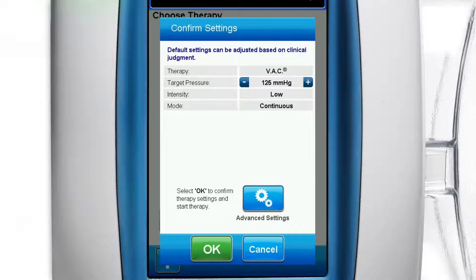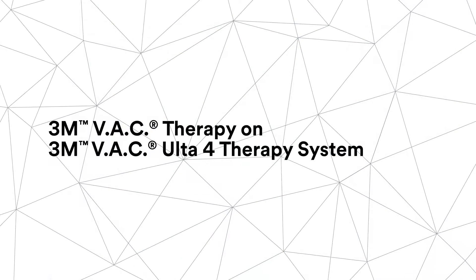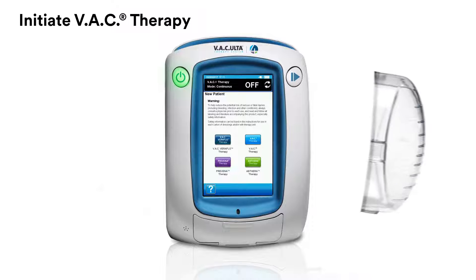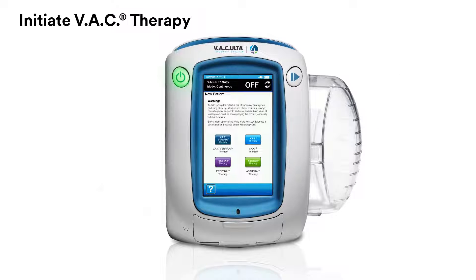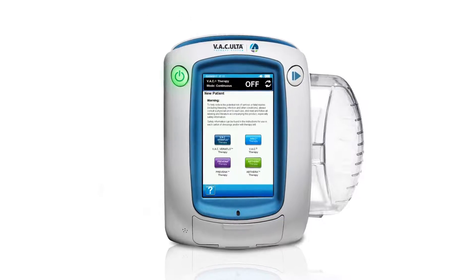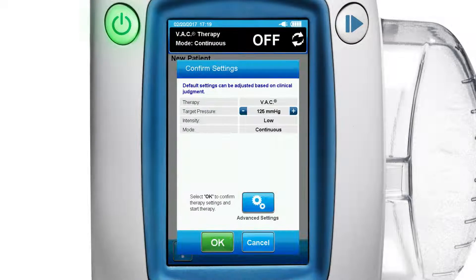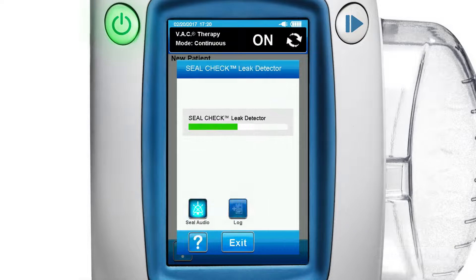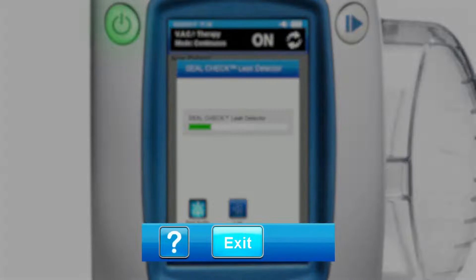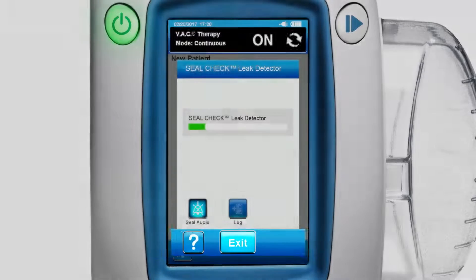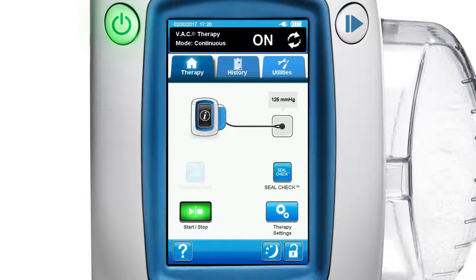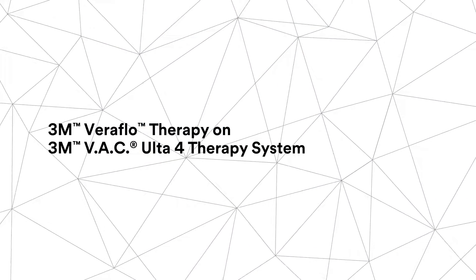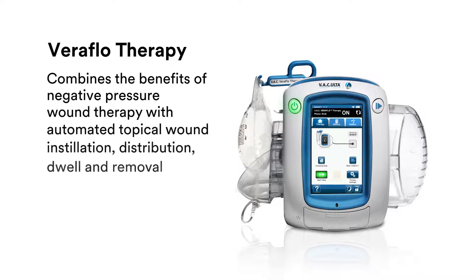Advanced settings are not covered in this video. To initiate VAC therapy, attach the 500 milliliter or 1000 milliliter canister to the VAC Ulta for therapy unit. Press the light blue VAC therapy button, then press the green OK button on the confirmation screen to accept default settings and begin VAC therapy. Press the exit button on the seal check leak detector screen to go to the active therapy home screen.